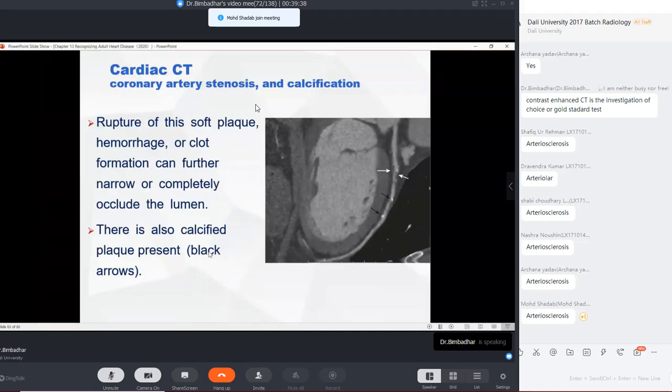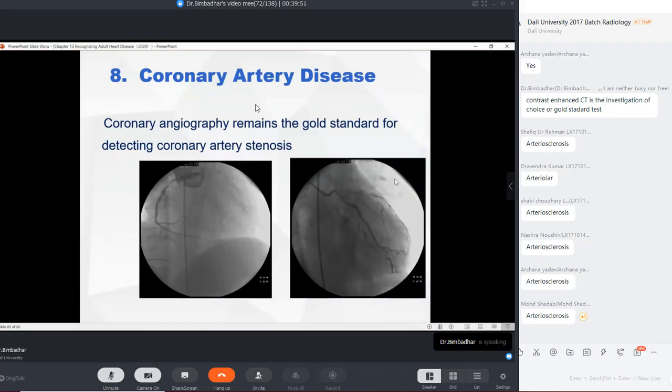Last one, that's it. I think you can understand here, right? Black arrows are the calcifications and the white arrows are the blockage by the sclerotic plaques. And you see here, this is the angiographic image. This will also be given as an image, and they will ask you to recognize the modality. They will not ask you to tell what disease it is. It's not necessary.